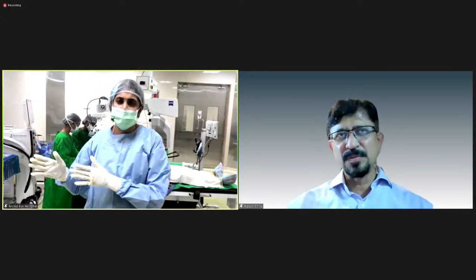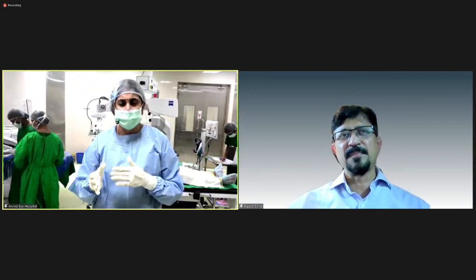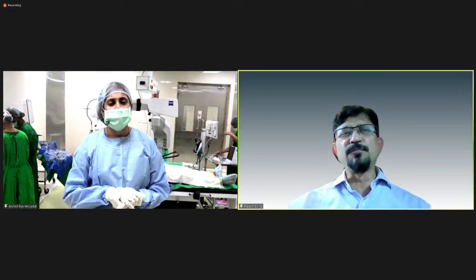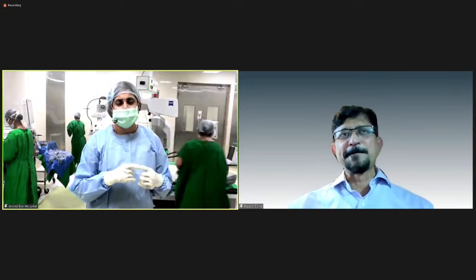Of course, for very hard lenses, I would use higher torsional and higher vacuum. But otherwise, even for subluxated lenses and myopes, I still have the same IOP and things work fine, actually. So yeah, with a good foot control, one can manage. True, it's a combination of the right technology and the technique.